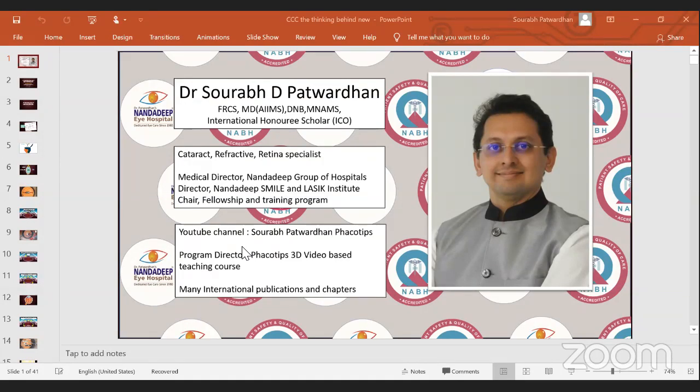There is another question: in extended rhexis, when to decide to shift from Phaco to SICS to prevent more harm? It is very interesting, I would say. In case of extended rhexis also, it is quite safe to do Phaco if you are experienced and you know the principle behind how to do Phaco in extended rhexis. The principle is that you never raise the anterior chamber pressure above 35 to 45 centimeters of water, so it is as if you are doing small incision cataract surgery. You can see my video on Phaco in extended CCC on my YouTube channel in my playlist. So you can watch that.